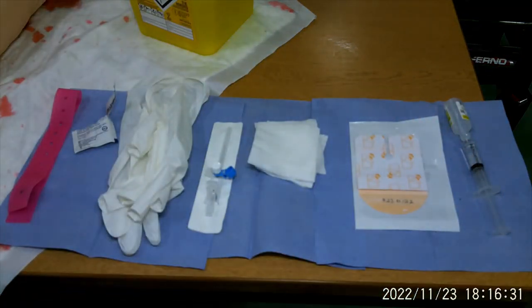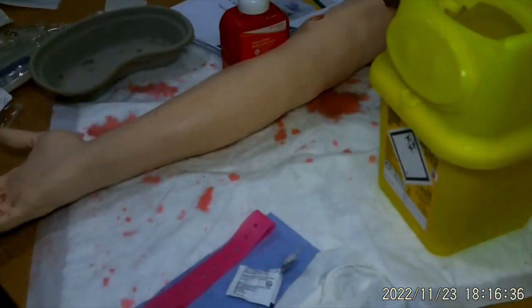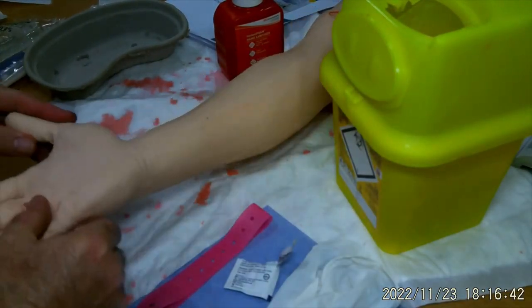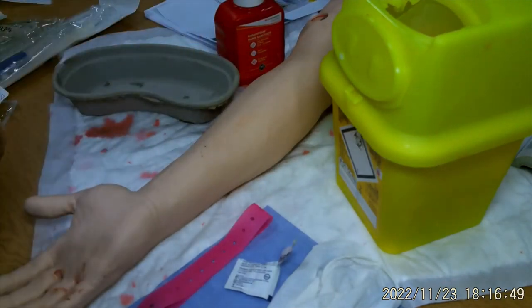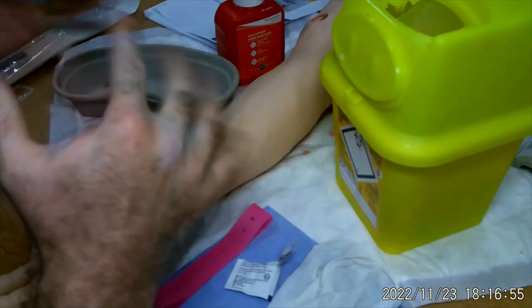So there's all my equipment ready to go. Now let's have a look at this — we're going to bring this in here. Make sure you've got all your equipment ready, get your sharps container nice and close, get your arm ready, make sure you've got some sanitiser to clean your hands. Now my hands are clean, allow that to dry.